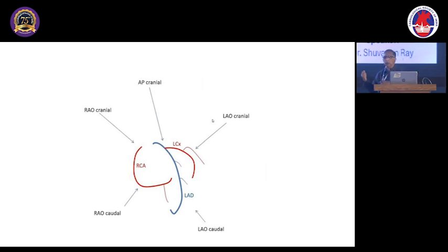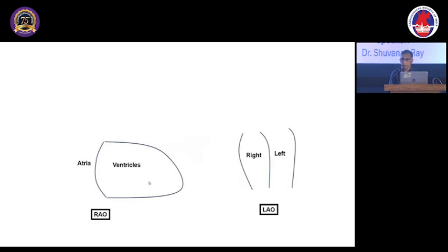If I give you an angiogram and ask you what you will do in this case, you shouldn't say, I won't do anything. Give me the history first. Give me the background first. Then I will do something. Otherwise, angiography is meaningless. So first, it is a clinical correlate of ischemia, number one.